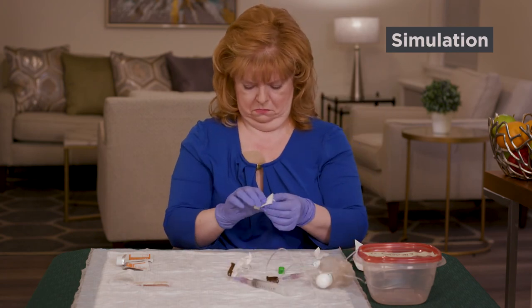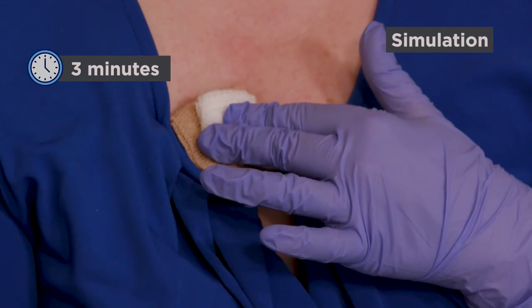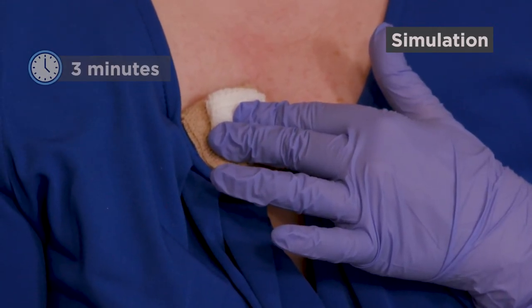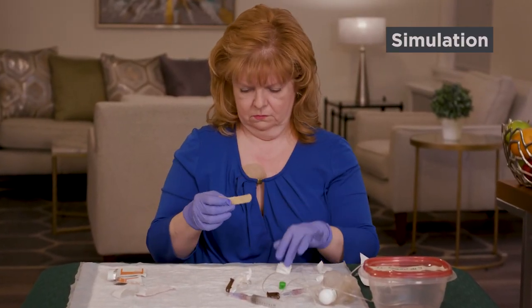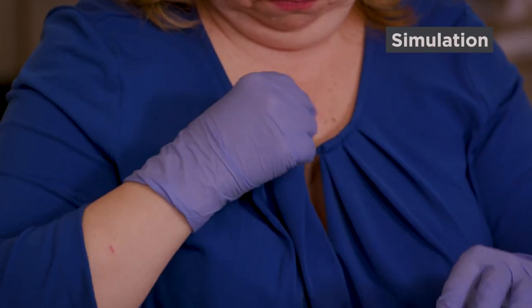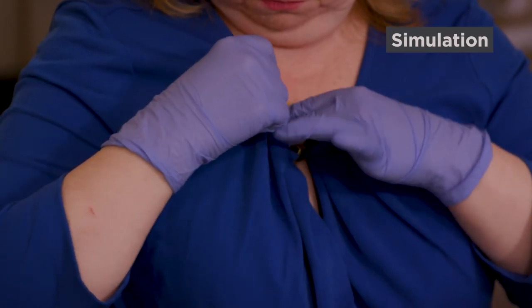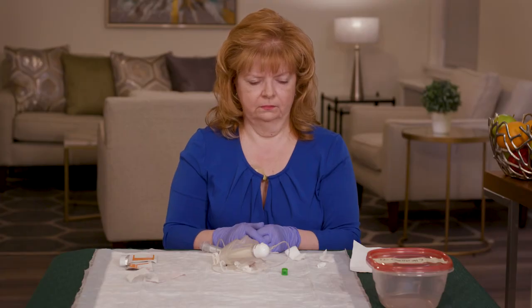Press the gauze pad over the area where the needle was for three minutes. Then place the bandage over the area. You're now disconnected from your elastomeric pump.